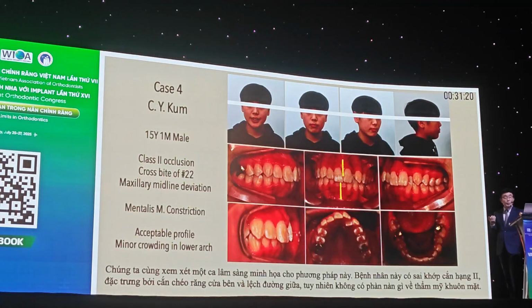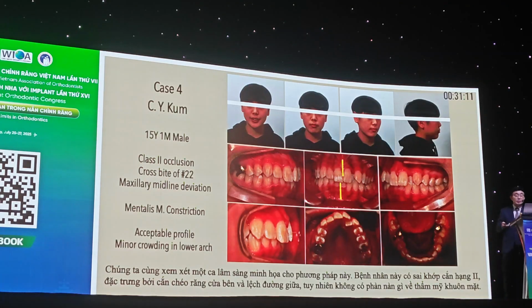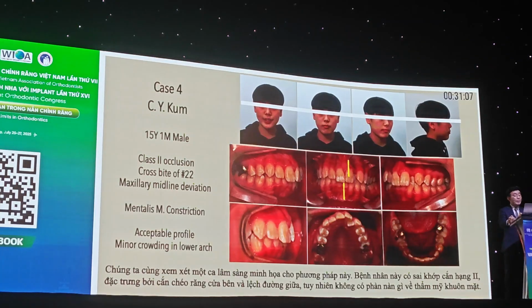exemplifies this approach. This patient presents with class 2 malocclusion characterized by lateral incisor crossbite and midline displacement, yet reports no concern regarding facial aesthetics.